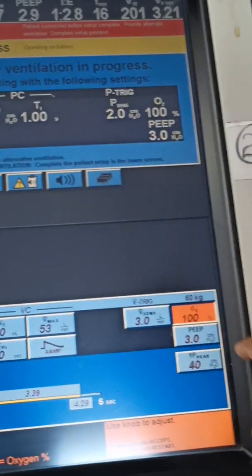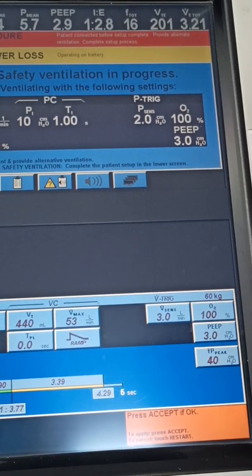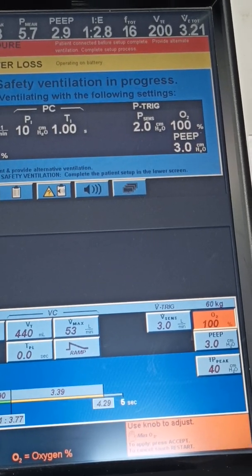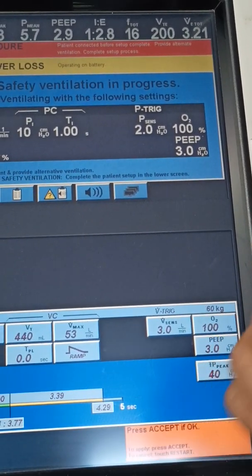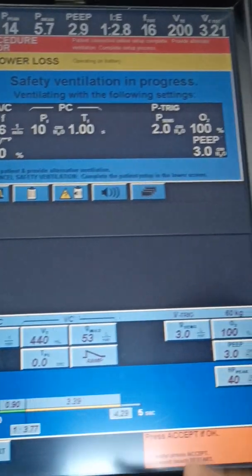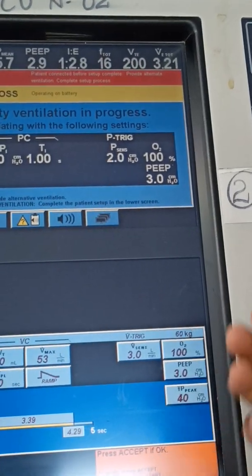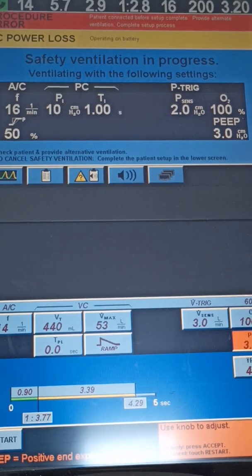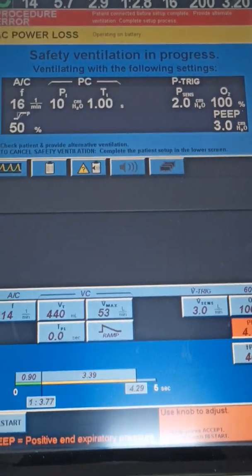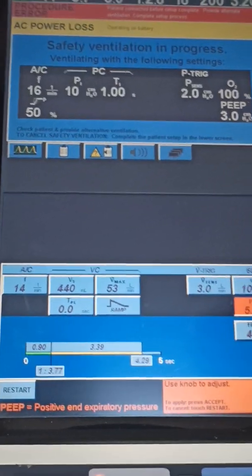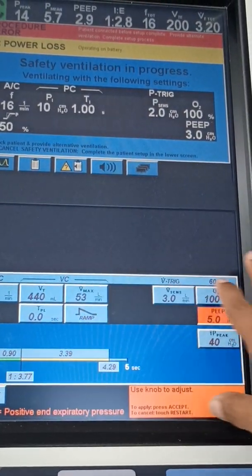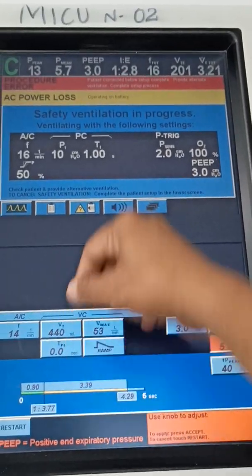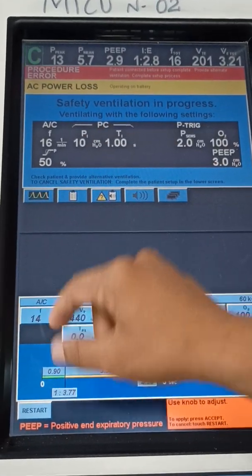Next on this side you will have FiO2. You can increase or decrease FiO2. FiO2 will be set based on the ABG values — PaO2 divided by FiO2. Based on that you will set the FiO2. Next, PEEP — usually you will give 4 to 5. Positive end-expiratory pressure — I kept it at 5. So in volume mode you set the tidal volume.